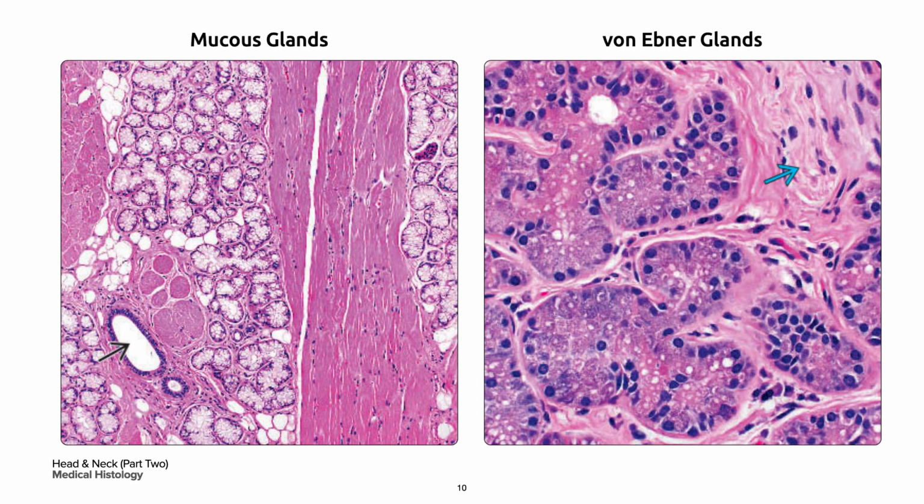On your right are the von Ebner glands, which are serous glands located only below the circumvallate papilla. Their ducts drain into the furrows to flush out its contents. Both serous and mucous glands in the tongue are intimately associated with nerves.